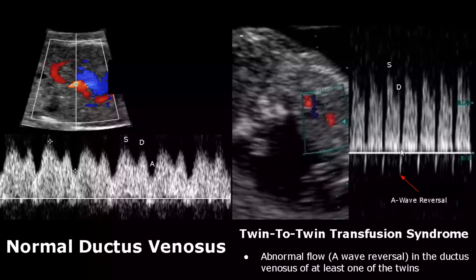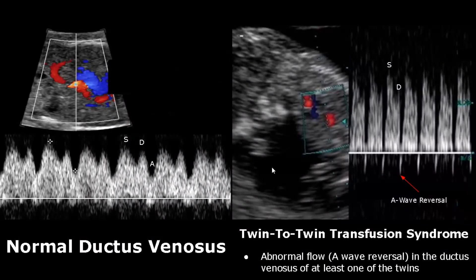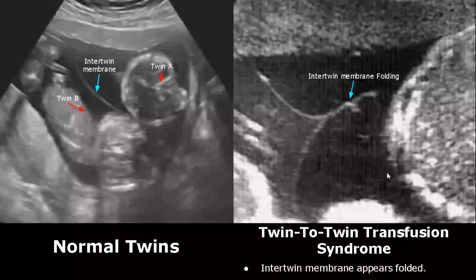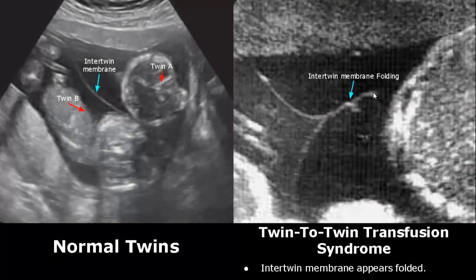Pulsed wave Doppler is very helpful in diagnosing twin-to-twin transfusion syndrome. Regarding ductus venosus, we may find A wave reversal in at least one of the twins — the A wave will be seen below the baseline, whereas the normal A wave is above the baseline. Twin-to-twin membrane folding may also occur and may be a signal of twin-to-twin transfusion syndrome.